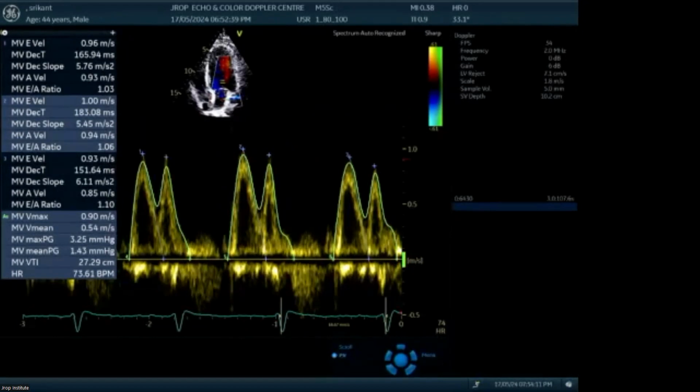So what we actually see in the ECG is not matching. This is the T wave, end of the T wave. You can change this complex. Unfortunately, the subject has gone away. You can change the leads from lead 1 to 3. We have an option to change them. You can see the beginning of the QRS complex and the end of the T wave.